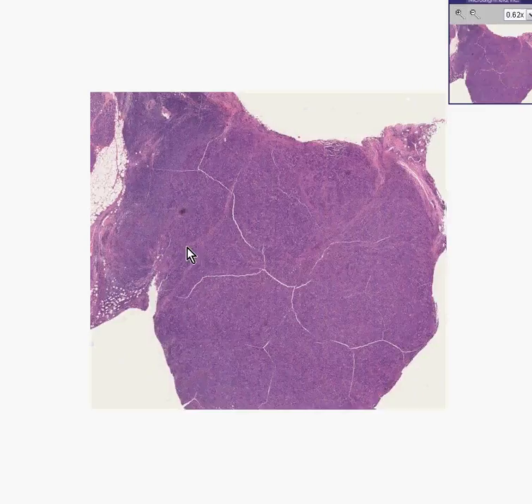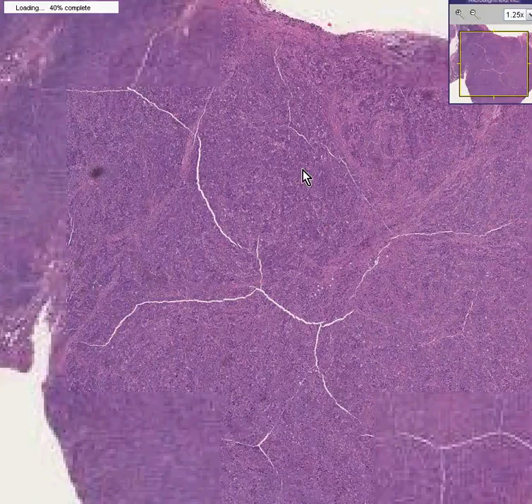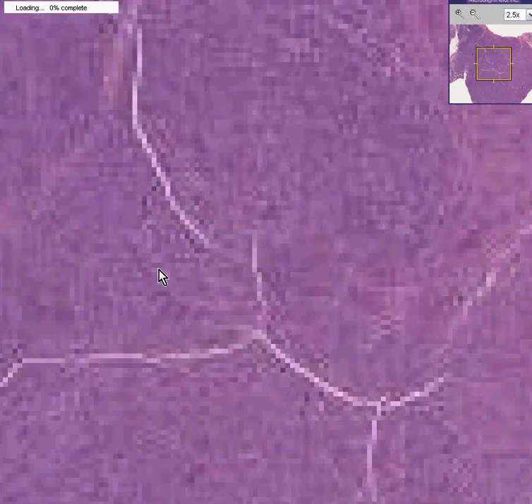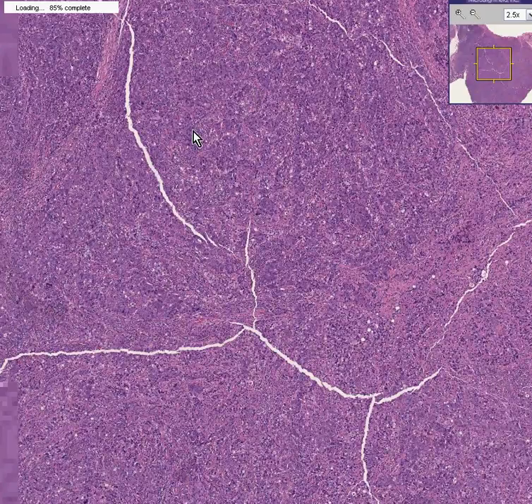What is this? Is it a lymph node? Is it malignant? Is it benign? Well, let's quit asking questions and zoom up a little bit. And you could see here, once again, very, very blue, very, very cellular. And even at higher power, you are thinking perhaps most of this is lymphoid. You're thinking, gee, maybe this isn't breast at all.